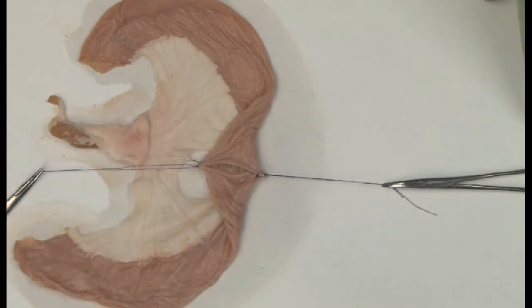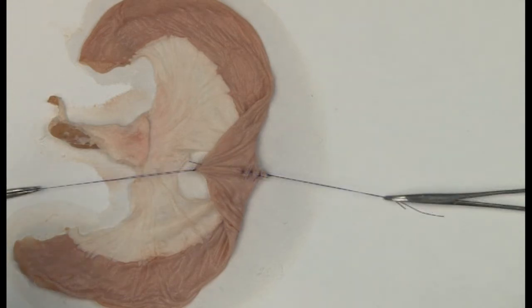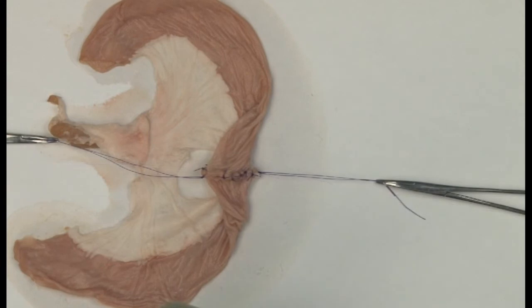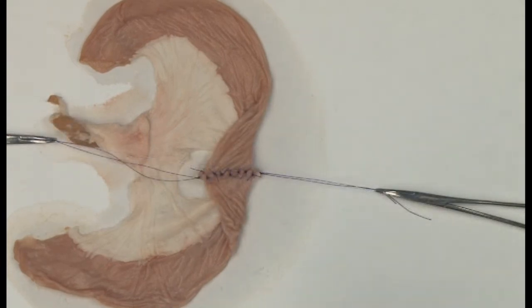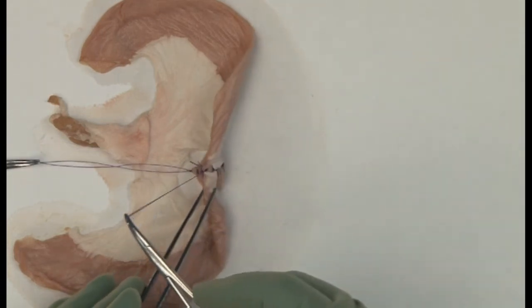Once again, insert sutures 5 mm apart using well-laid reef knots and hand ties. Make sure that the angles of the anastomosis, the so-called 6 and 12 o'clock positions, are adequately sutured since these are the most likely areas to leak.